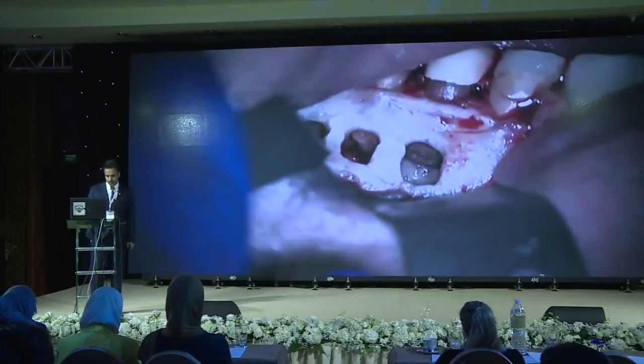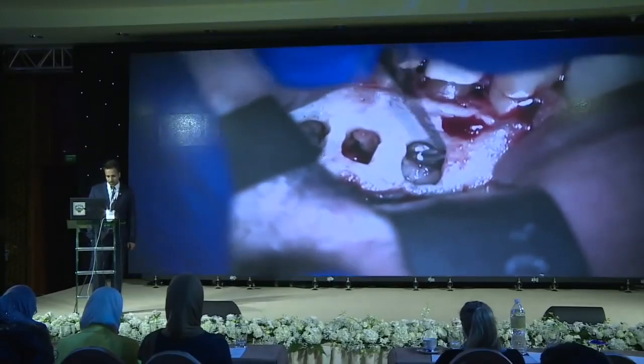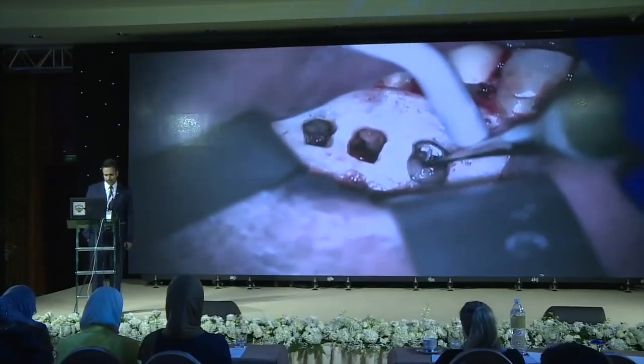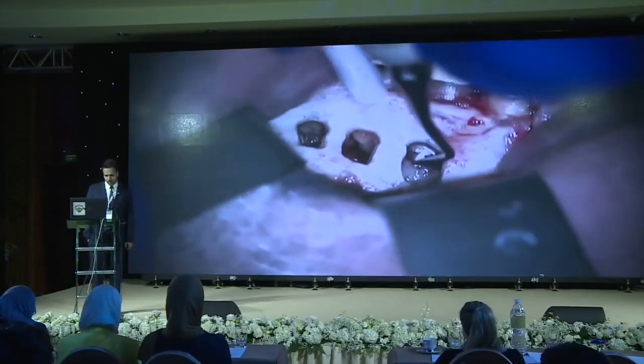Some of the sealer. This is where the bioceramic putty is placed. And this is the microplugger.